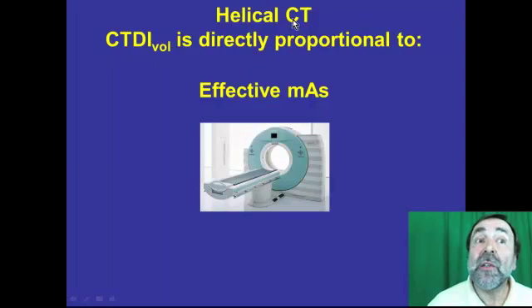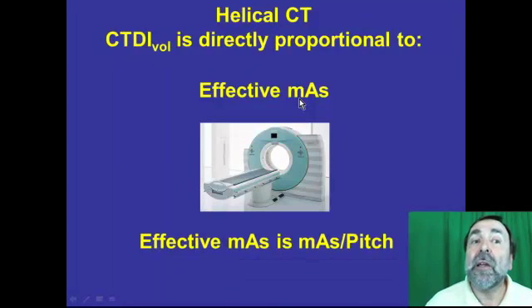So in helical CT, CTDIvol is actually proportional to the effective mAs. And let me remind you what the effective mAs is. It is the mAs that you have divided by the pitch.